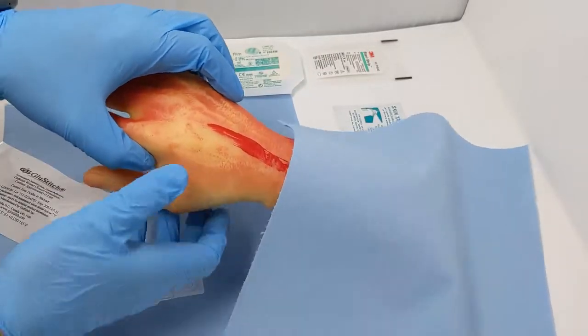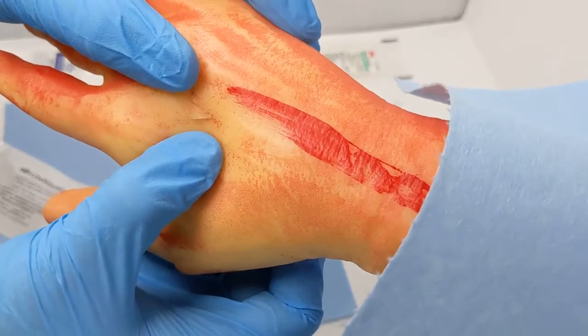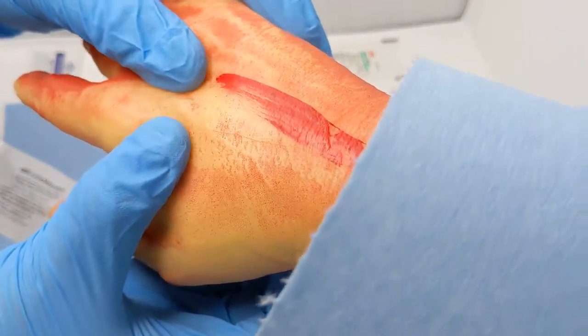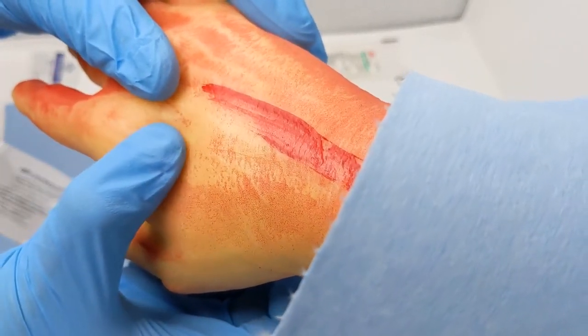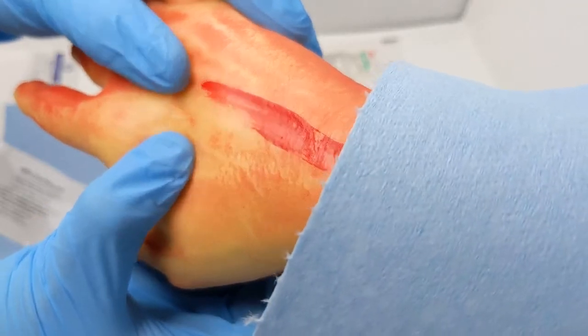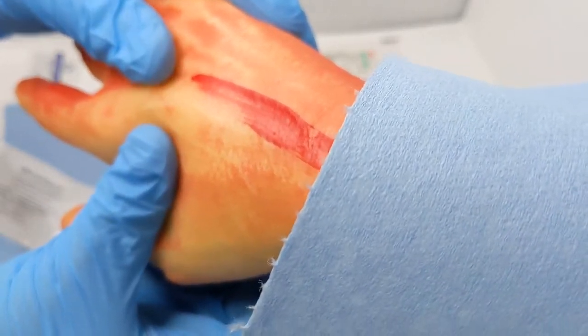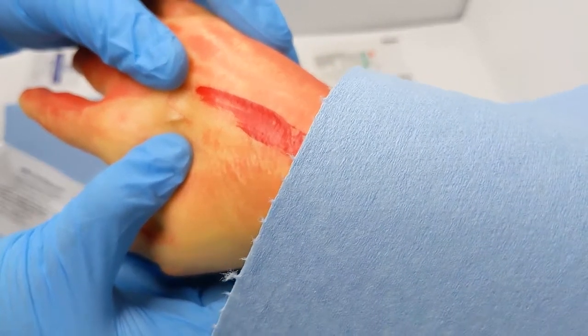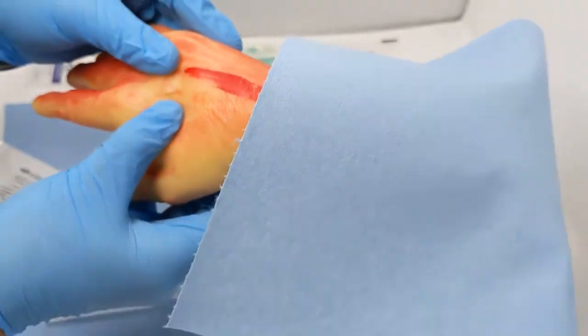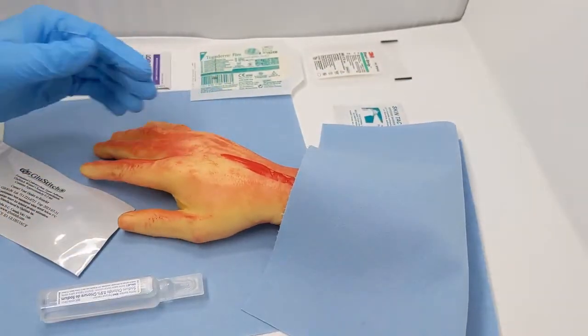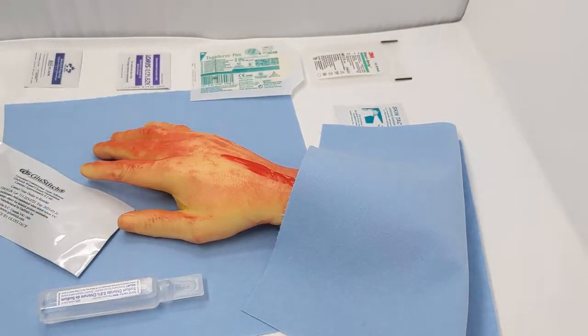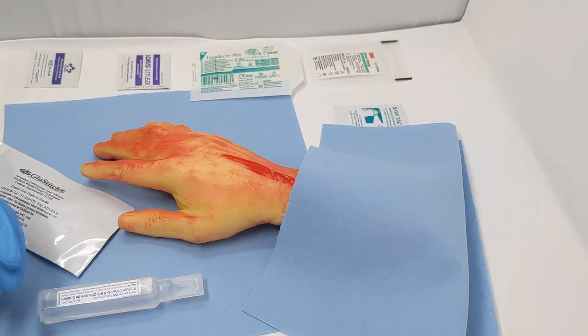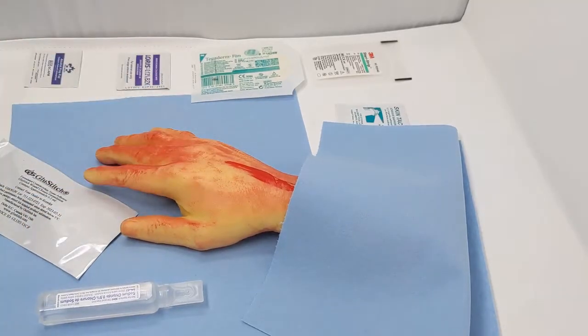Looking at the wound here on the hand, we have a small laceration. It's nice and straight, superficial, no puncture, and no significant contamination. Those would all be times we would not consider gluing. If there was a puncture, lots of contamination, or a deep wound, we would want to leave it open and allow for dirt and drainage to come out. But this one looks uncomplicated.